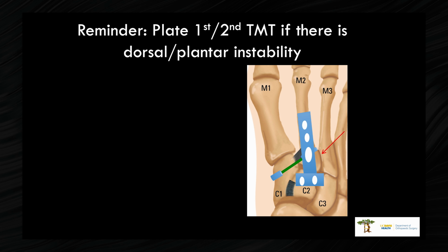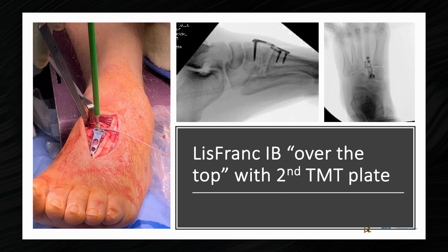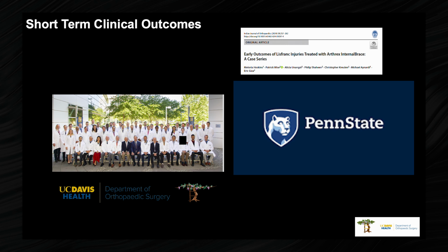One thing, where's the whys? This is my little schematic showing that, if you have really bad second TMT instability, you should bridge plate, but then also put the LisFranc InternalBrace underneath. You can see that there, and that was someone also with first TMT instability. But here it is. You can still do second TMT plating. This was a professional mountain biker here in California. We did that, and then we took his plate out at about 4 months, and he was back doing his thing.